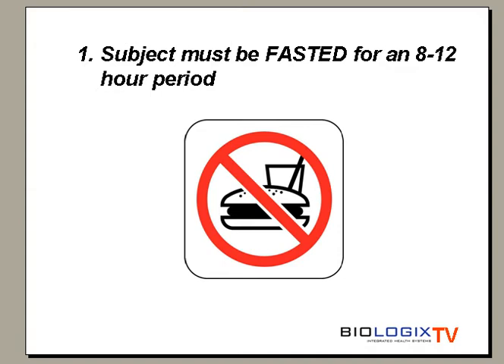It's okay for clients to drink water to stay hydrated, just be sure they have nothing to eat or drink prior, as the thermogenic effect of food will contribute to data above the qualifying resting metabolic rate number.